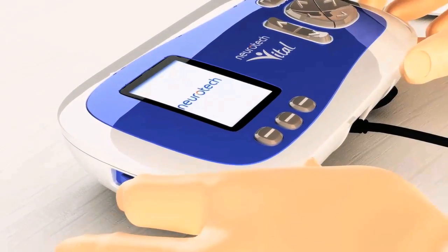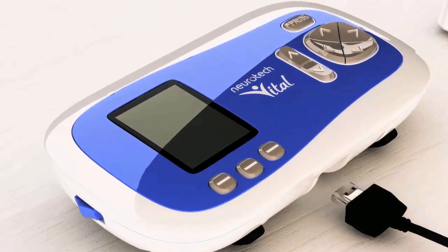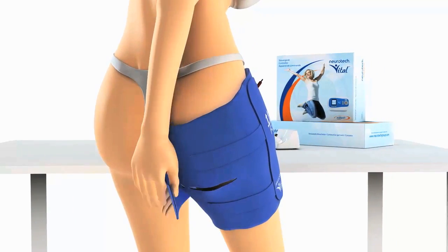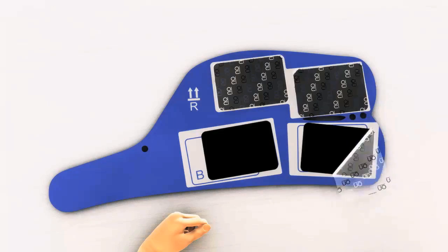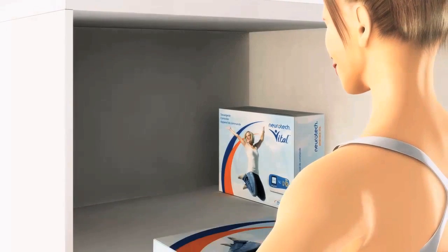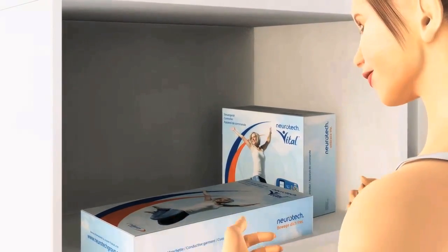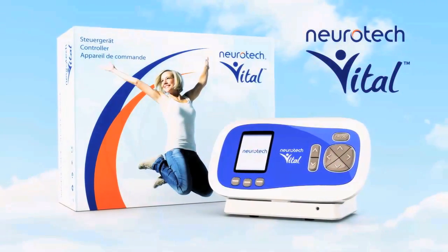The treatment session lasts 30 minutes. When it's over, switch off the device, unplug the connecting cables and take off the thigh garments carefully. Put the protective covers back on the electrodes. When you put them away, please make sure that the electrodes don't get folded over. Keep the thigh garment somewhere out of the sun until your next treatment session.